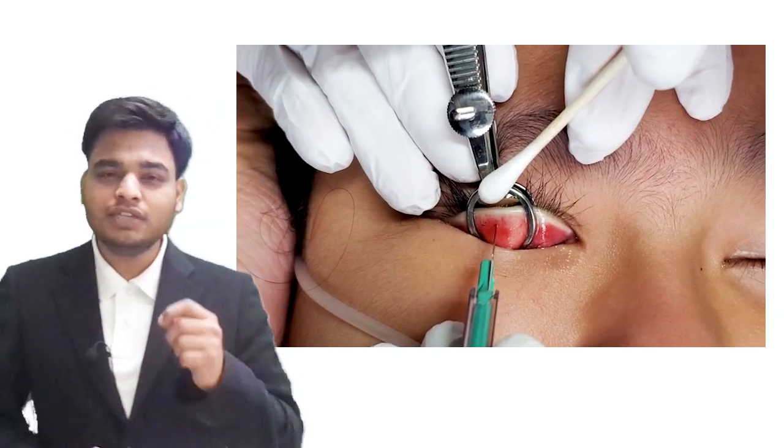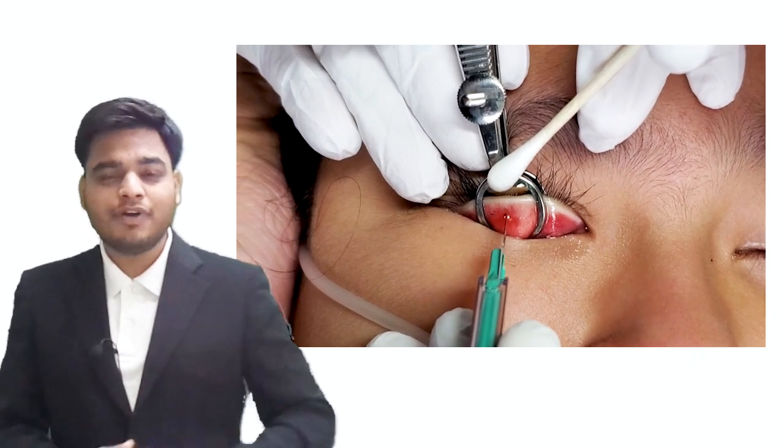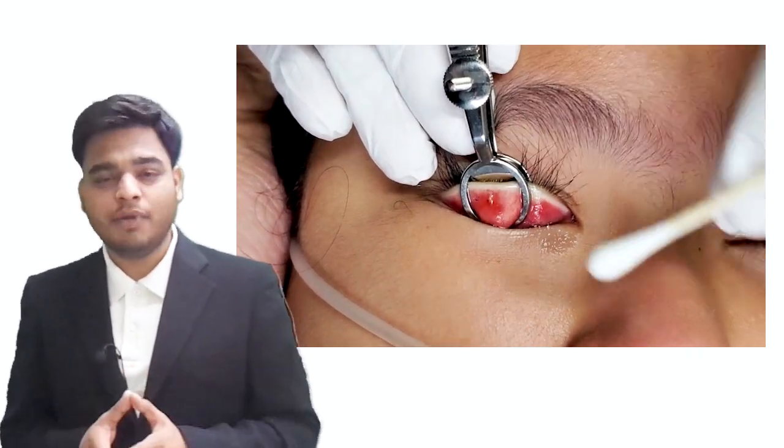Step number four: incision. A vertical incision is made on the lesion with the help of a Bard-Parker size 15 surgical blade.